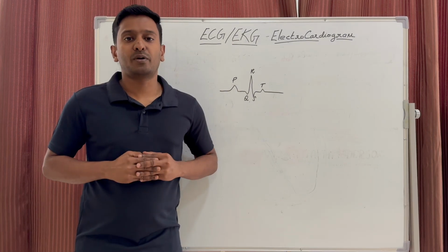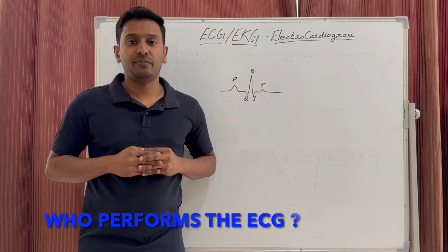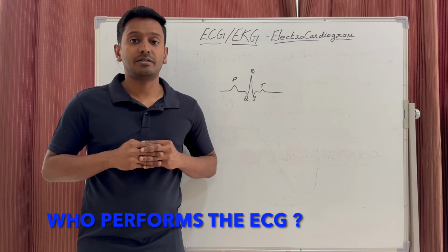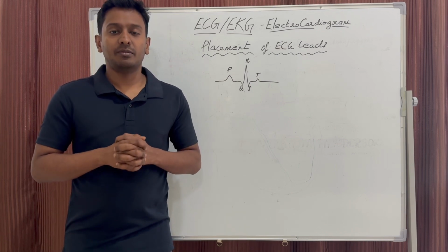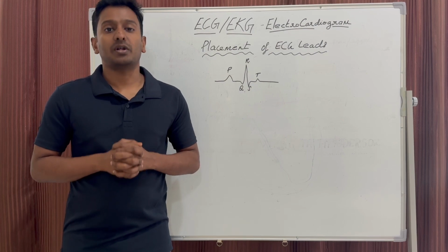So, who performs the ECG? After getting a verified order from the doctors, the ECG technician or the nurse will do the ECG. At the same time, if the situation is a real emergency, we can do the ECG without prior advice or order.